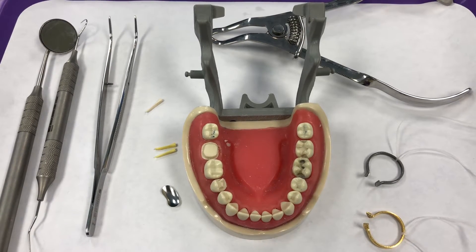This video will show you how to assemble and place a sectional matrix system on a posterior tooth. There are a wide variety of brands out there to choose from. Some are easier to use than others, but they all have a similar concept.